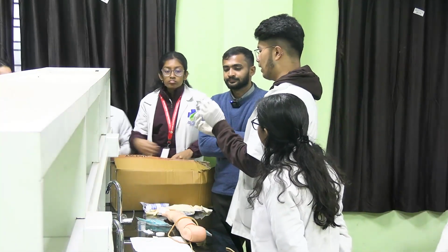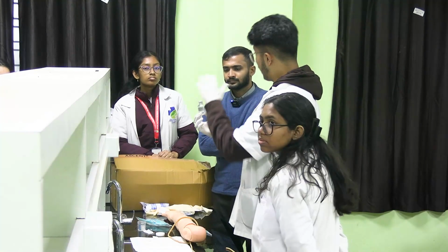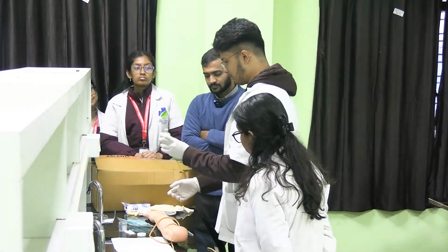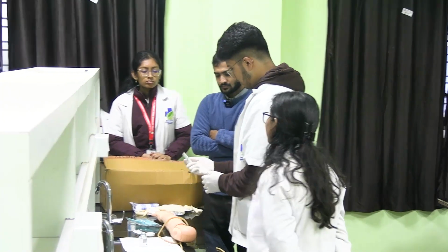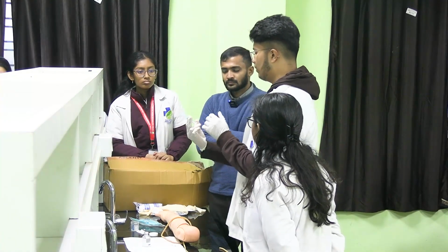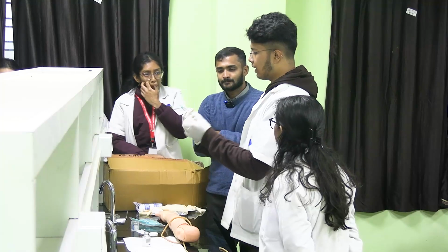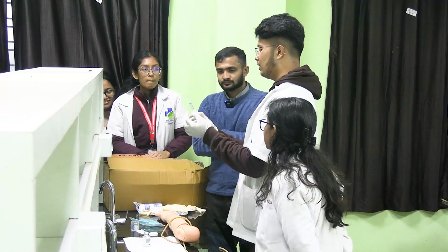Then, sir, I'll have the rubber cap and plastic cap. I'll first remove the plastic cap and use the cotton swab to sterilize the rubber cap. After this, I'll take the needle, sir. For example, my dose will be 1 ml. Before that, check whether the plunger is working. It's working, sir.